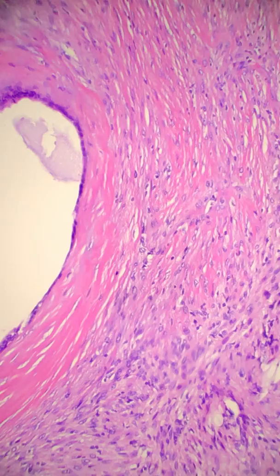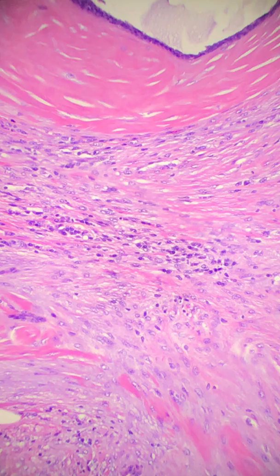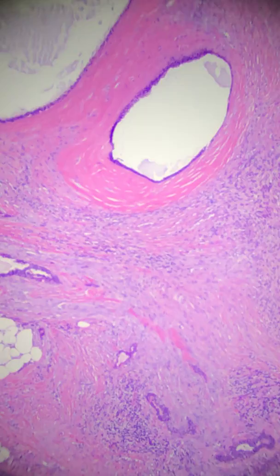That helps you figure out that you're looking at more likely a metaplastic spindle cell lesion over malignant myoepithelioma. And the other thing that helps you is, although I didn't see it in this lesion, these lesions often will have ductal carcinoma in situ or DCIS, either mixed into the tumor itself or on the edges of the tumor. So those are things that can kind of help you.